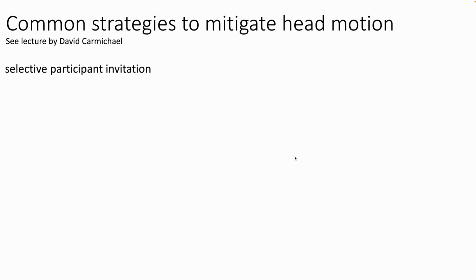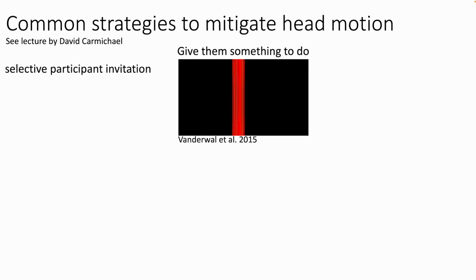Finally, as we will learn from David in the later lectures too, prevention is better than cure. Where in high-resolution fMRI, we are a bit privileged. Namely, in most fMRI studies, we have the luxury to simply blacklist participants that cannot lie perfectly still, and we scan them never again. Motion prevented. I also found it very helpful to let participants watch their favorite show. I learned this from my kids too. Give them something to watch and they sit still like a statue. And while there is scientific evidence that Netflix improved data quality, I could not yet convince my institution to buy a subscription for me. And obviously this is only applicable for some functional studies.